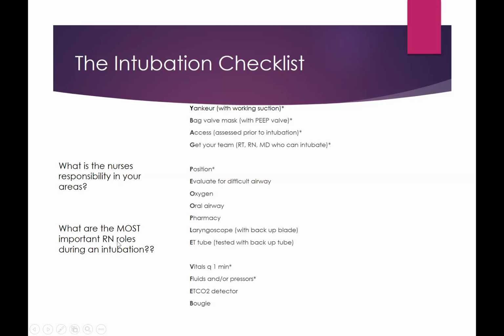Other parts for a registered nurse that are very helpful and important during intubation: the physician who's intubating has their back to the monitor and is really focused pretty narrowly on the patient's airway itself, as is the respiratory therapist, who is responsible for equipment and getting things set up and available. So the nurse in the room is really vital to monitoring the actual patient at this point.